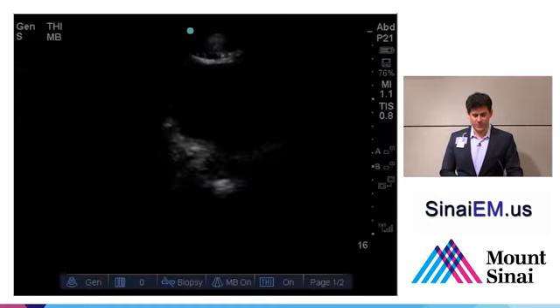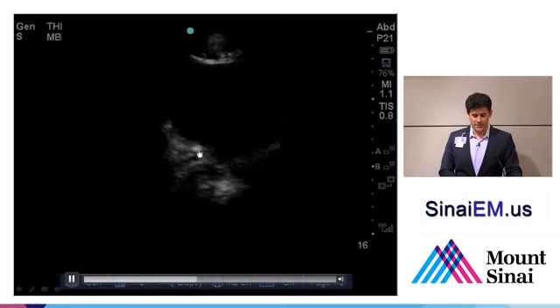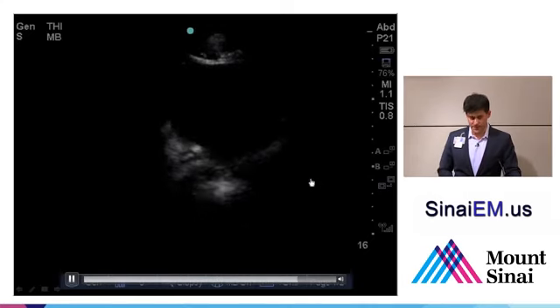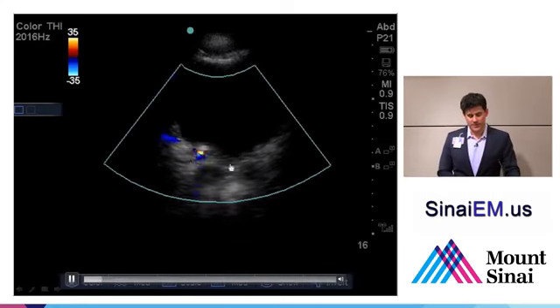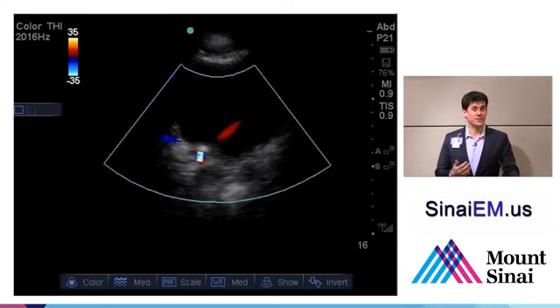So here we see a transverse view through the bladder, and on the right-hand side here, so here's all this bladder, it's anechoic area, and on the right lower area near the trigone of the bladder we see again this bright white hyperechoic structure, and that's again consistent with a kidney stone trapped at the UVJ. We're seeing two things here when we throw a little Doppler on there. Adding Doppler demonstrates a ureteral jet, which seems to be coming right out of that area, and some authors describe ureteral jets, which is basically the urine being squeezed out of the ureter into the bladder, so you can actually watch these streams come out. So that suggests that there's not a complete obstruction, because otherwise there wouldn't be any urine coming through that ureter on the affected side.